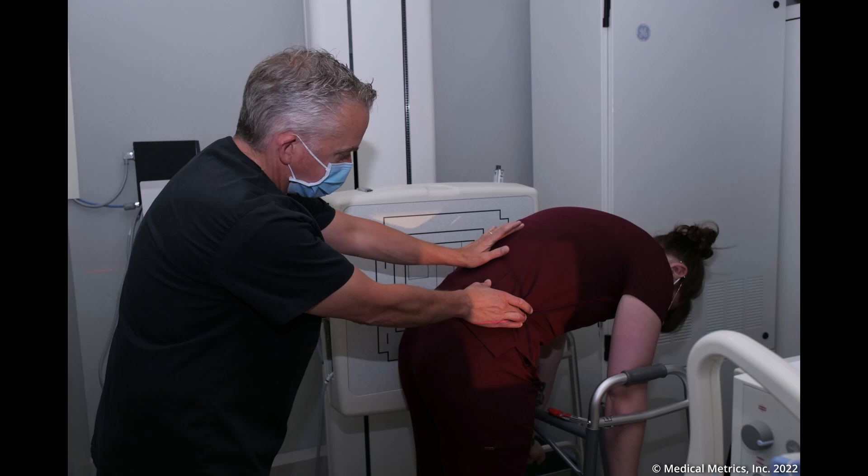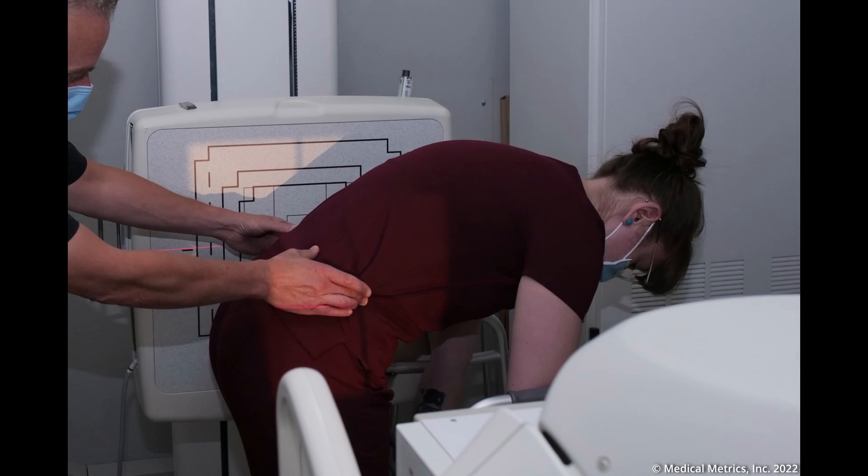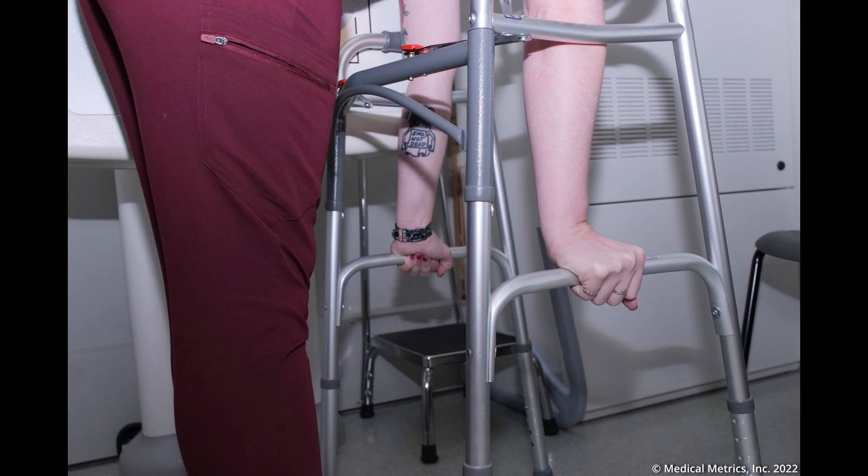Ask the patient to bend forward enough to allow for beam centering on the iliac crest, expecting that the patient will bend forward more with your encouragement. The flexion x-ray should allow visualization of T10 to the lower sacrum. Ask the patient to bend forward as much as possible and encourage them. Ask the patient to grab the lower bars of the walker to assure that the patient is maximally flexing and not twisting or bending to the left or right.